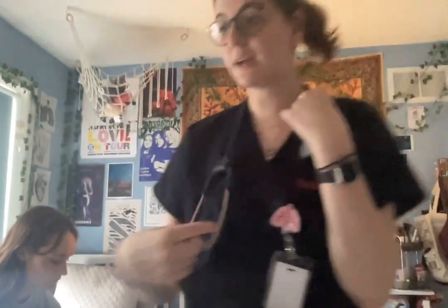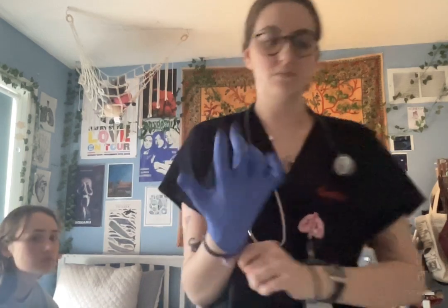So I'm going to begin by doing my hand hygiene and putting on my gloves. And then I'm going to go ahead and clean my stethoscope, the bell, and the diaphragm with an alcohol swab.